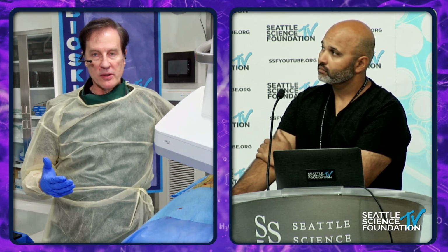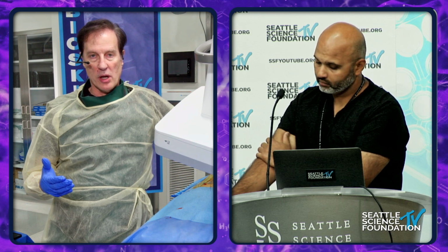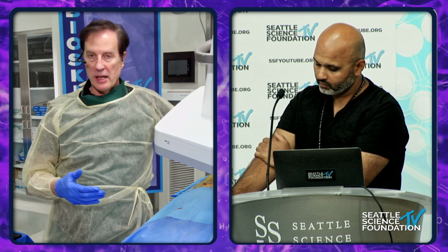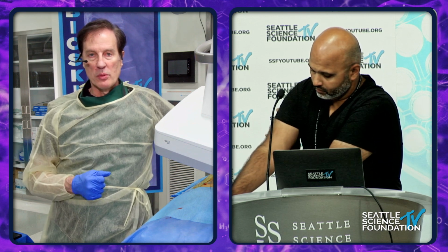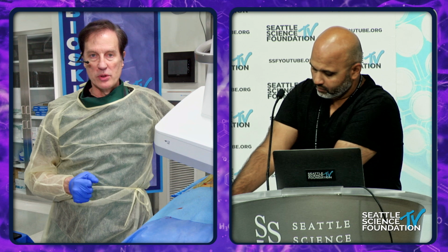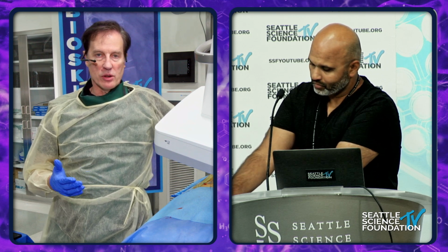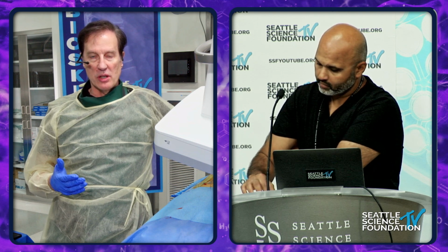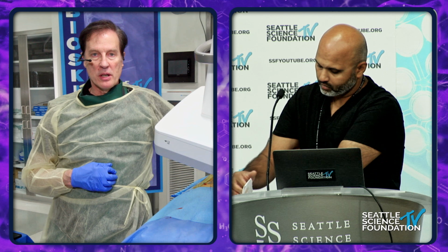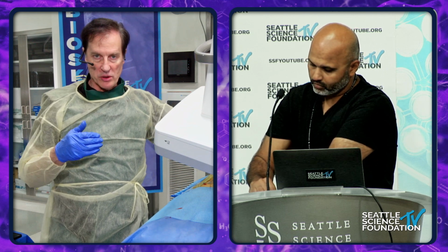It's a prospective multi-center clinical follow-up trial, registry type trial measuring PROs, and really good pain and functional improvements. Every single practitioner who participated in this was interventional pain or interventional radiology. The other trial that we just finished is called the Stacy trial by SI-BONE using laterally placed torque screws. So most of the data that we have is based on the lateral approach.